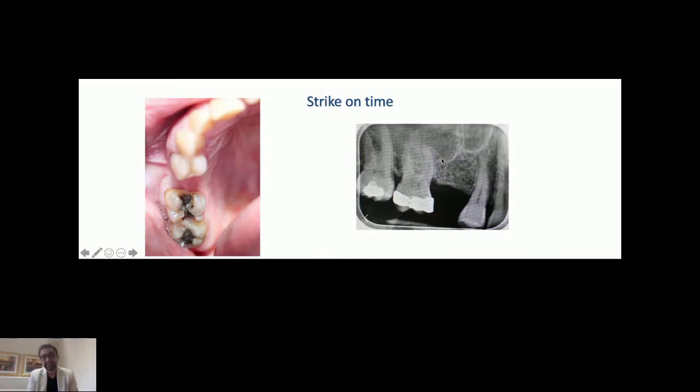That's going to be the key in all the planning. So this is the minimally invasive way you can treat patients in the posterior maxilla. Rather than sitting 1 year down the line thinking about a lateral window, you can actually utilize this 4 millimeter. I know we've got a great surgeon hidden in all of us, but it's time to let the surgeon sleep and care about our patients so that they can have the problem resolved in a minimally invasive way. So have a look at this case.